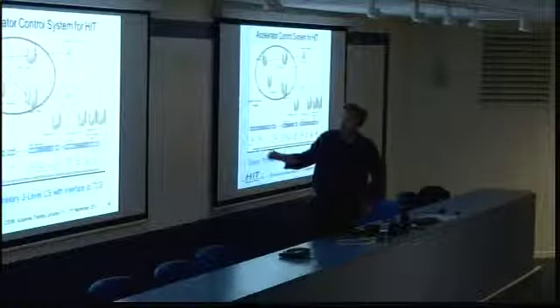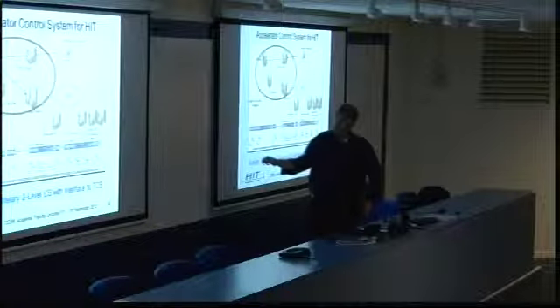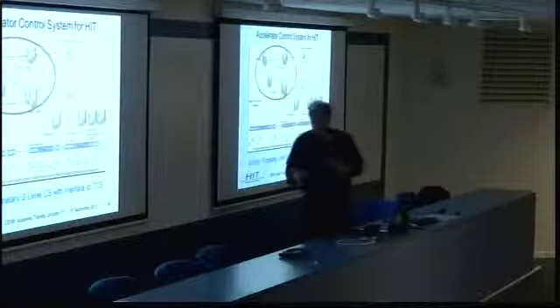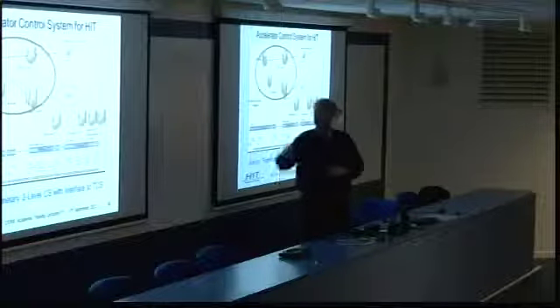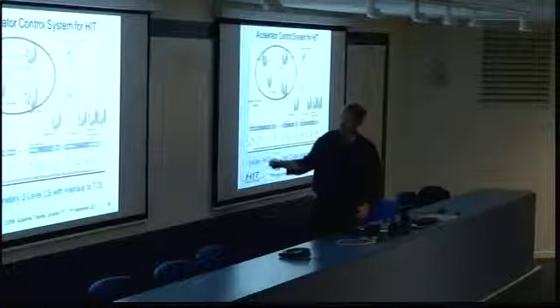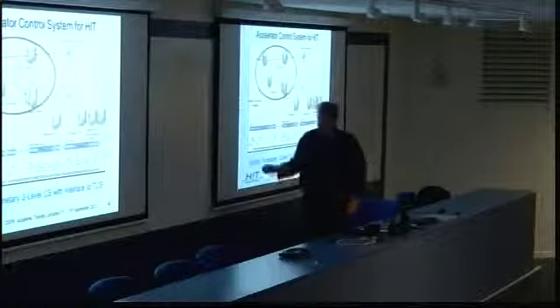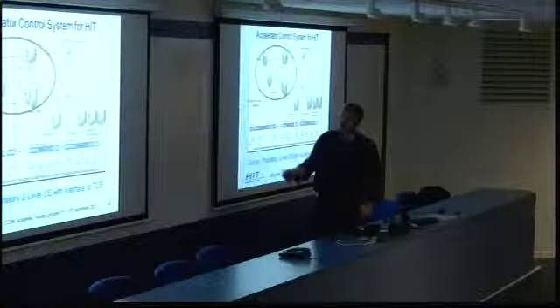Okay, this is the real-time level, which needs a real-time bus. So we have some main events in the machine, like now inject the beam, now start the extraction, and so on. This is only a few commands which go along this real-time bus. Everything else is done by programmed delays.